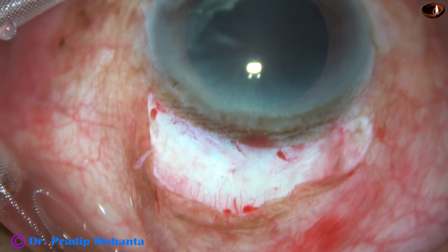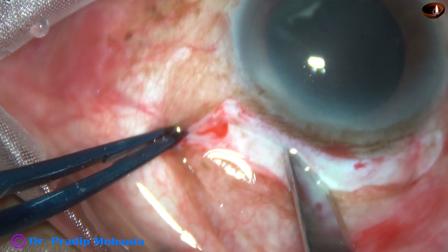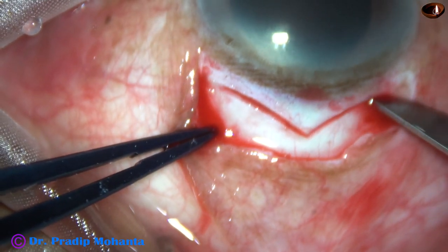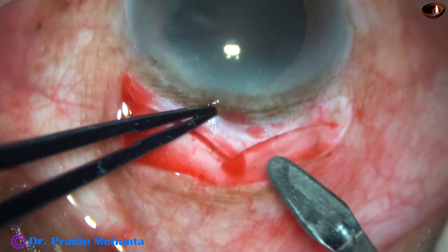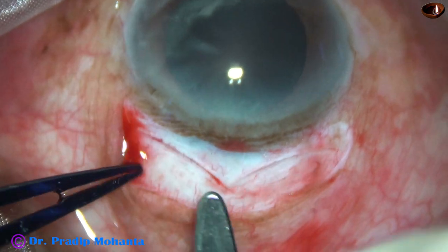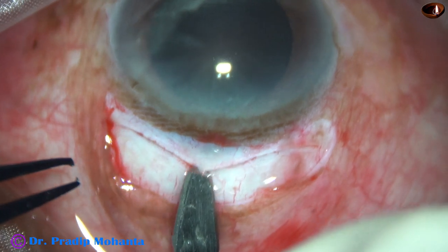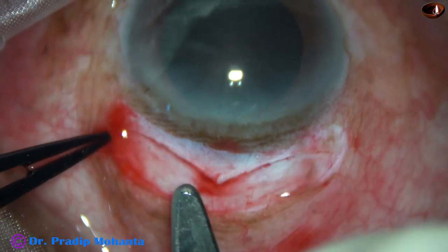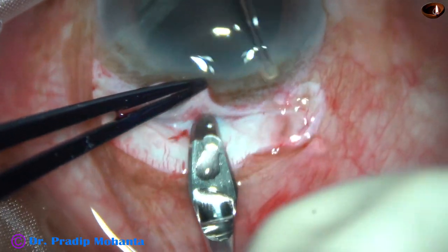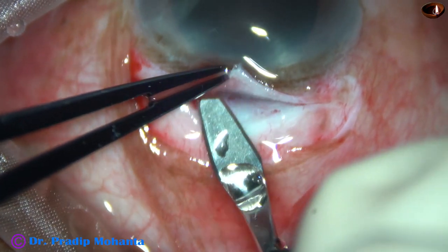Now the incision. I am going to place two SICS incisions — this one is about 5.5 millimeters and this one is about 5 millimeters. Two SICS wounds have been placed adjacent to each other and a sclerocorneal tunnel is being made as we do in SICS. Those surgeons who do SICS will find this a very easy option. Two SICS wounds join each other and we just have to place one suture where the two incisions meet, at the apex of this V-shaped incision.